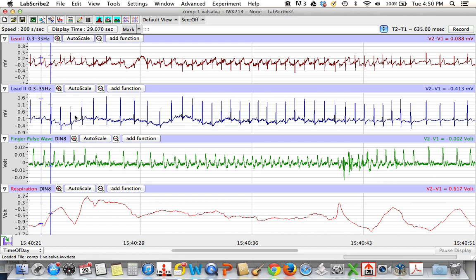And so that first thing, your instantaneous heart rate, you can measure through your EKG. And maybe one of the leads looks really noisy. You can use the other one if that works. And if that doesn't work, you could also possibly use your pulse wave as well. Just use the peak of the pulse wave to try to measure it if your EKG is not looking too hot. Then what you can do is correspond this to the different phases.